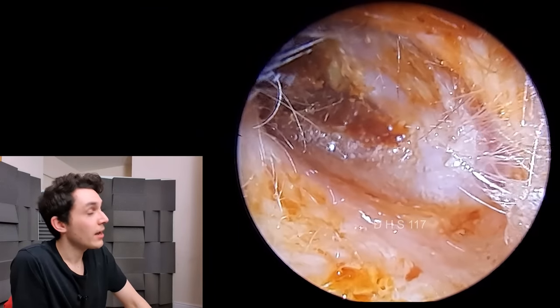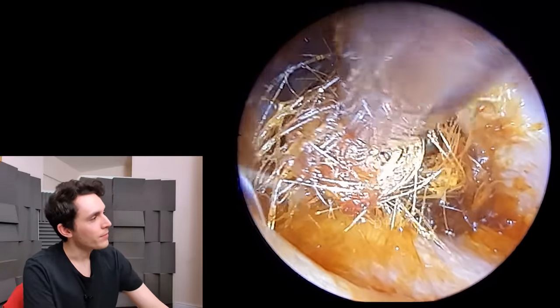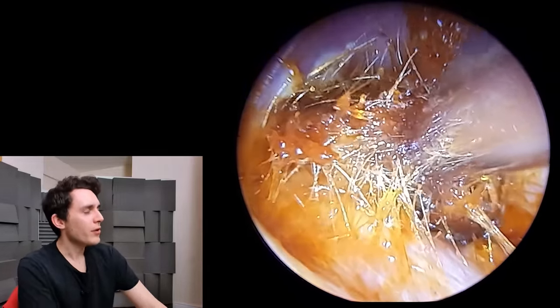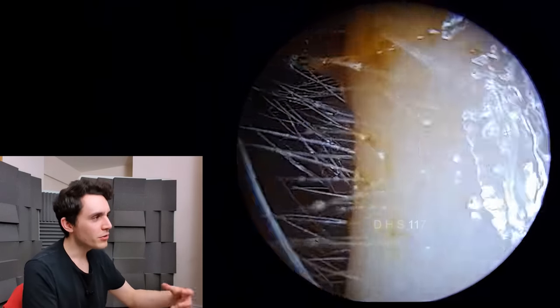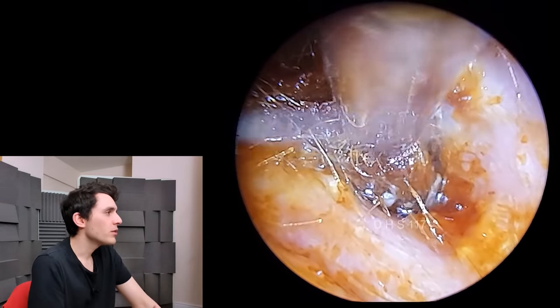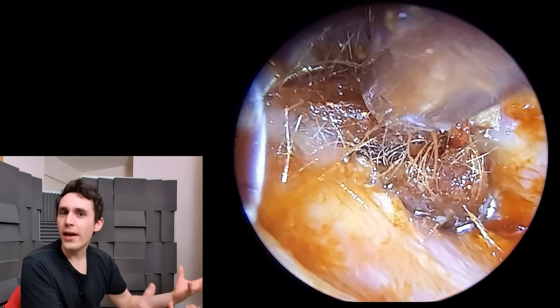That was kind of annoying for me. I actually preferred the look of the higher frame rate, even though it was in a lower resolution. What I've discovered over time by using different cameras is that the frame rate of the endoscope camera makes a huge difference to the overall image quality. The resolution plays a part — it's better to film through an endoscope in 4K rather than 1080p — but the contrast, the light, and what you can see are massively affected by the frame rate. Also, performing the procedure at 60 frames a second just looks nicer, more akin to real life. After much faffing, I've got a new camera attached to the endoscope. This is what you're seeing here. We're back to the deliciousness of 4K at 60 frames a second.